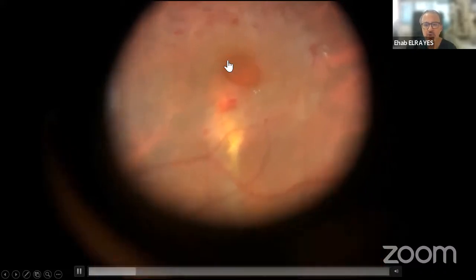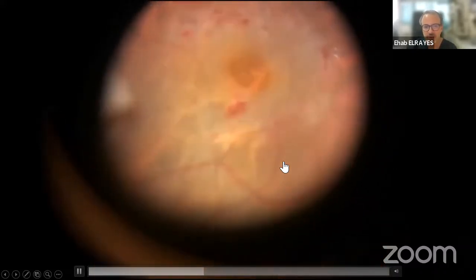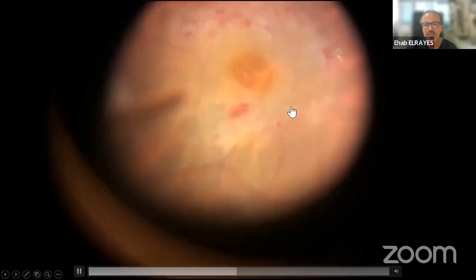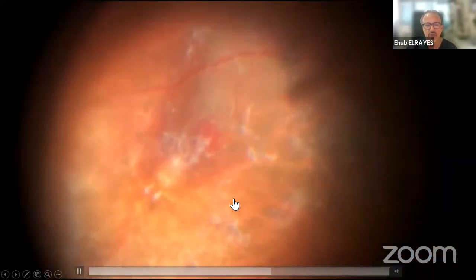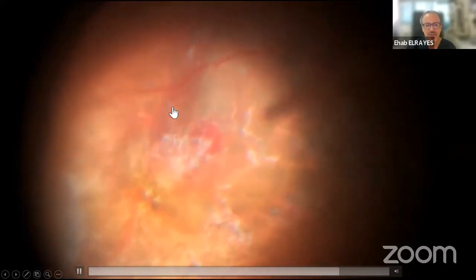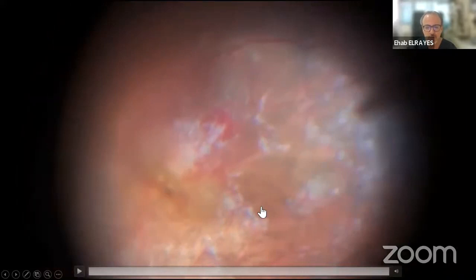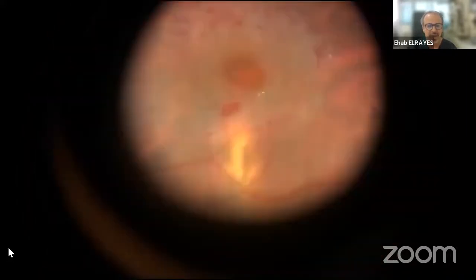Another patient like this: chronic macular hole that we removed the ILM several times, myopic, failed to close. Again, in the suprachoroidal space, you start to inject, and in this slide, you can see the expansion of the choroid. What happens? The choroid starts to elevate. We just need a good choroidal support, not too high, to support the area of the macular hole.